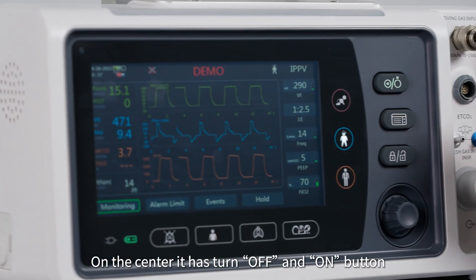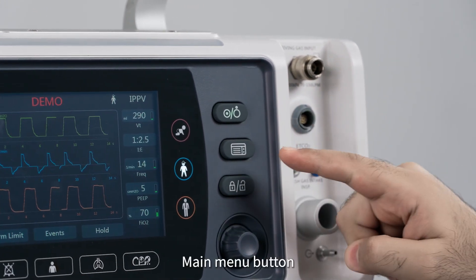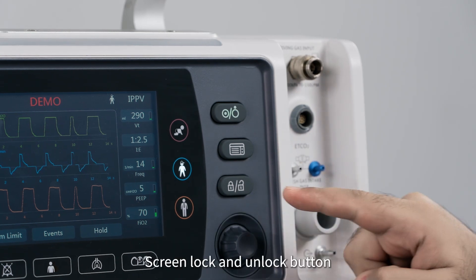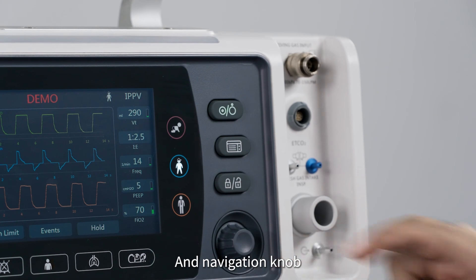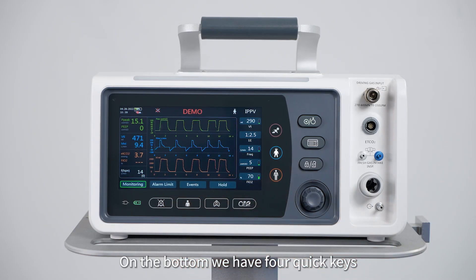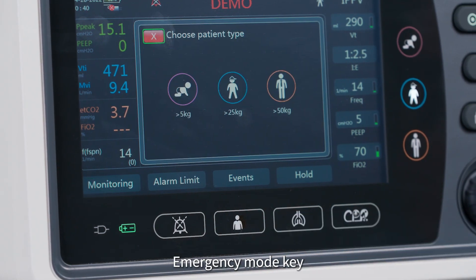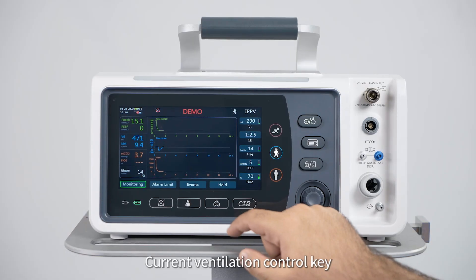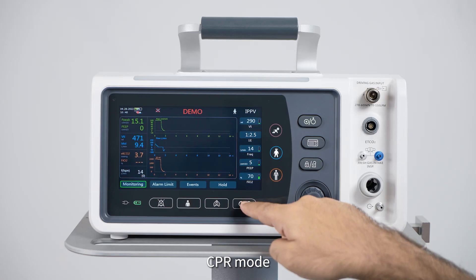On the center it has a power on/off button, main menu button, screen lock and unlock button, and navigation knob. On the bottom we have four quick keys: alarm mute key, emergency mode key, current ventilation mode control key, and CPR mode.